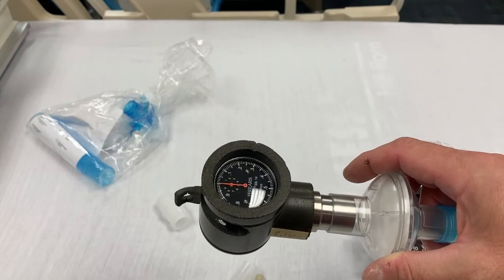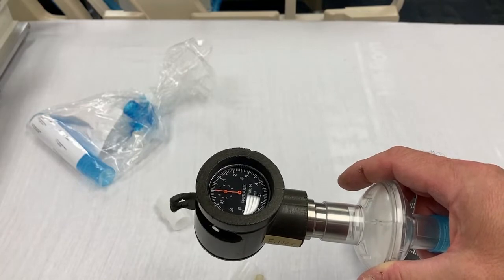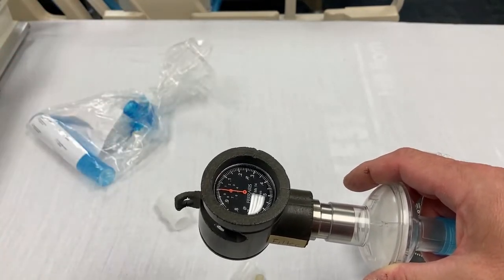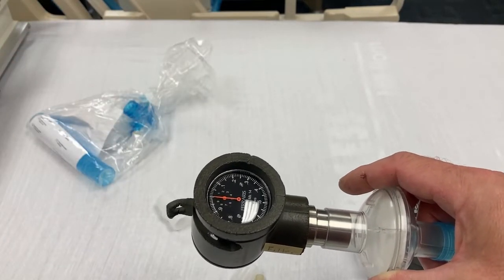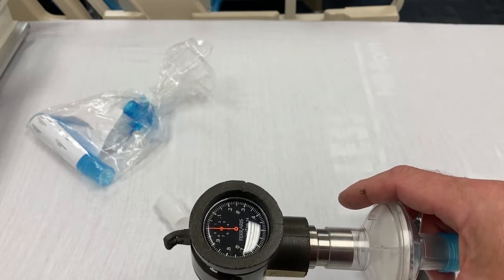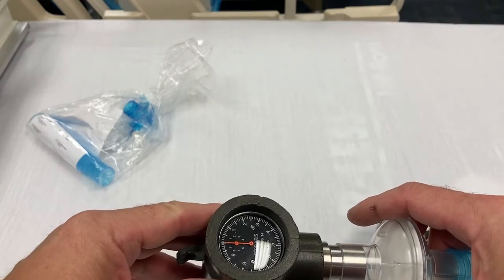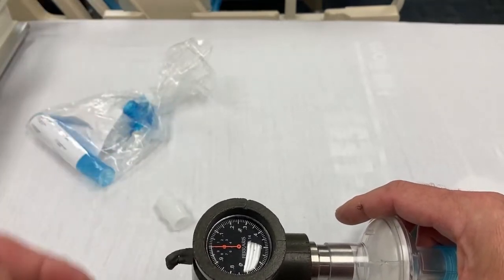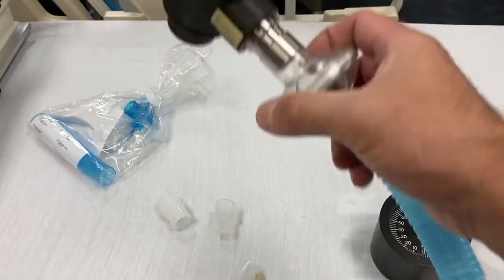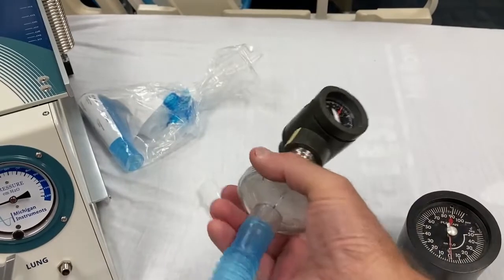And I like to find either on my watch or a clock on the wall, and wait until the second hand comes around to something I can remember, whether it's the 12, the 3, the 6, the 9, whatever. And as soon as it crosses that on the clock, I hit the reset button, and that way I'm starting. And as it's running, let me see if I can get this hooked up and give it some breaths here.